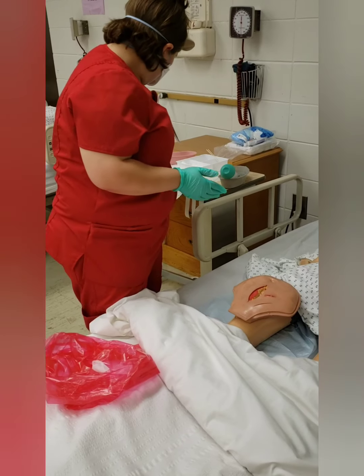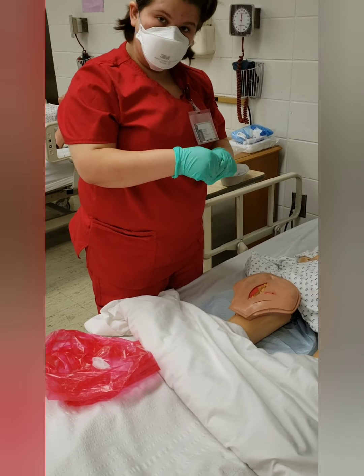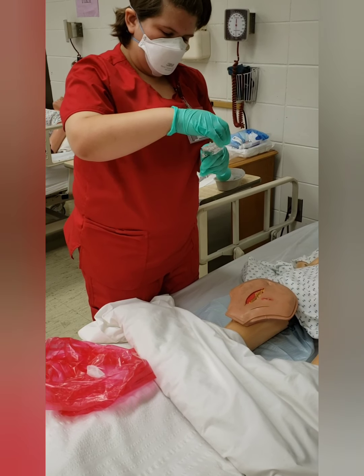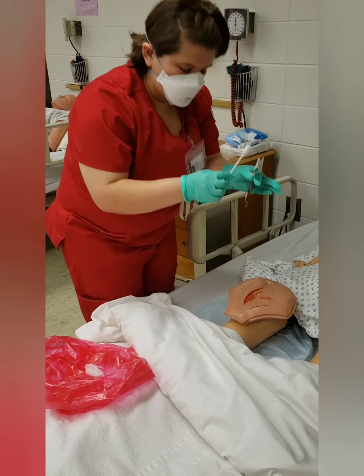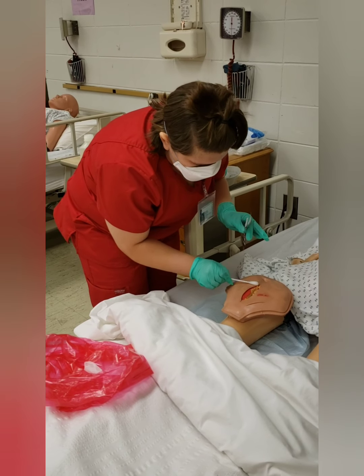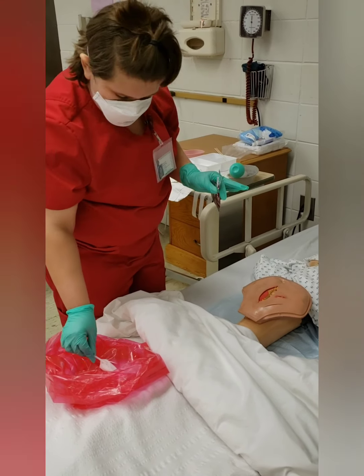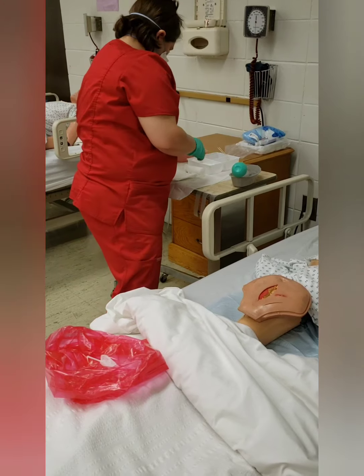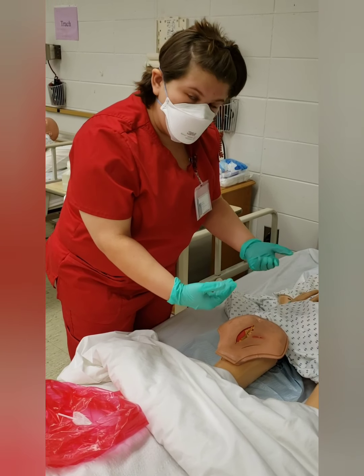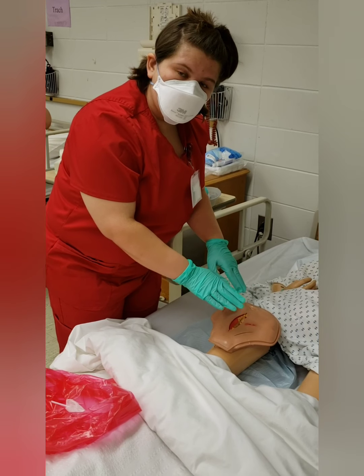I'm going to get some cleaning agents. This is a microbial agent. I'm going to clean the outside skin around the wound. Be sure not to get this inside the wound, just the outside. We're going to let that dry. We just got done letting it dry, and now we are going to measure the wound.